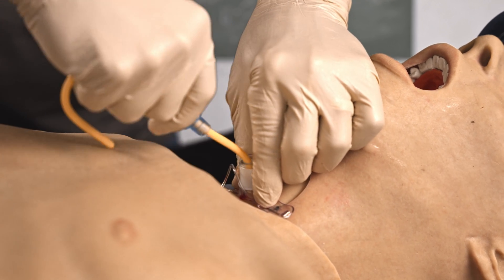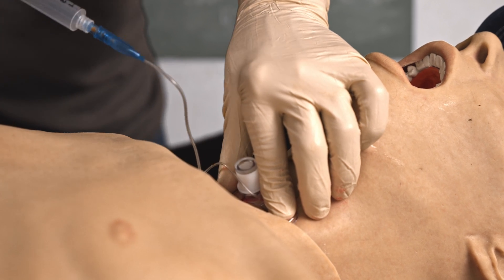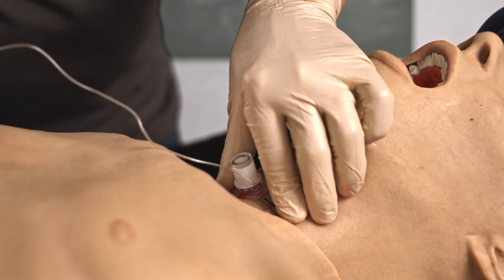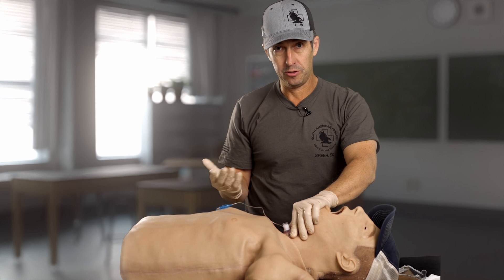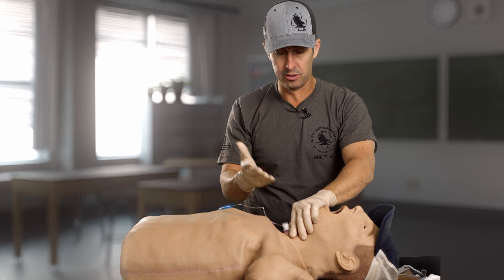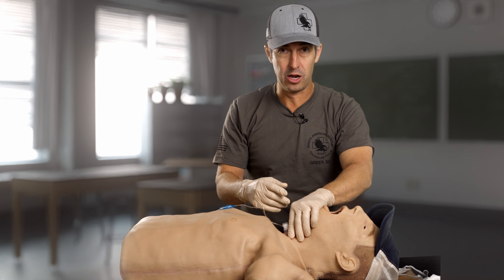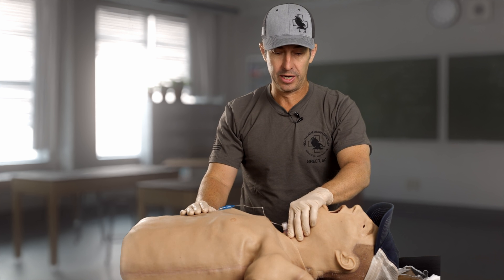I then remove the bougie. At this point, I'm going to inflate the balloon with about 8 to 10 mls of air. I check my balloon and make sure it's inflated — feels good. At this point I would grab a BVM and give my casualty a breath or two if they're not breathing on their own, or watch for spontaneous rise and fall of the chest indicating they're breathing through the trach just fine. I'm also going to confirm placement using an end-tidal CO2 detector like an EMMA, listen to lung sounds, and reevaluate my casualty as I go.